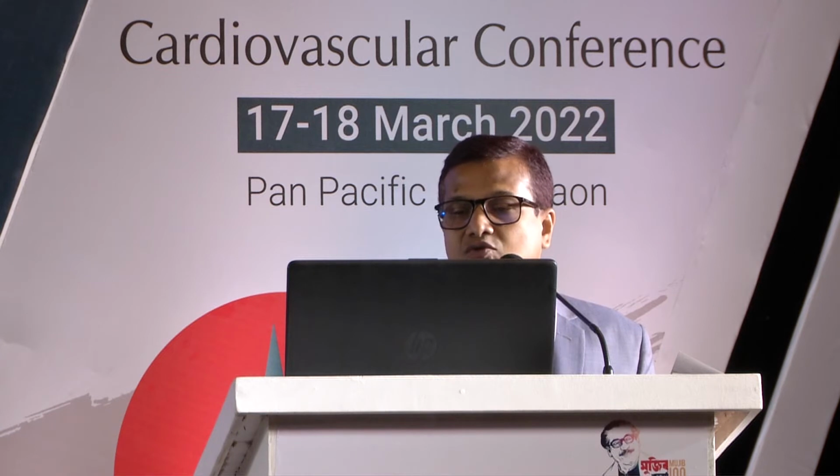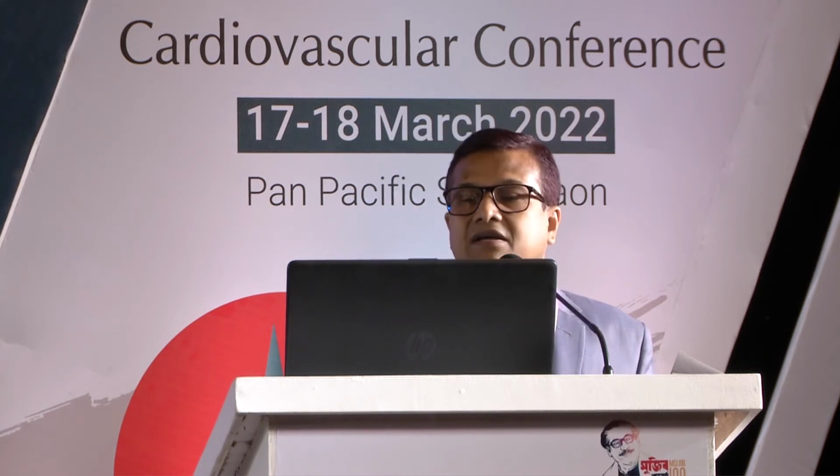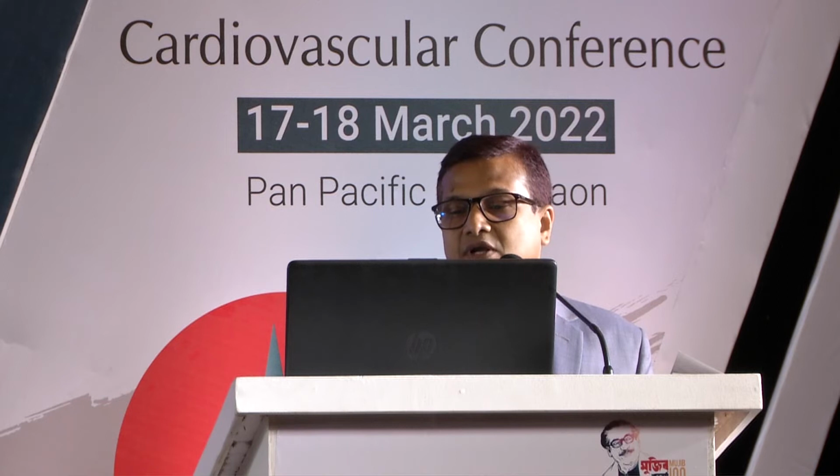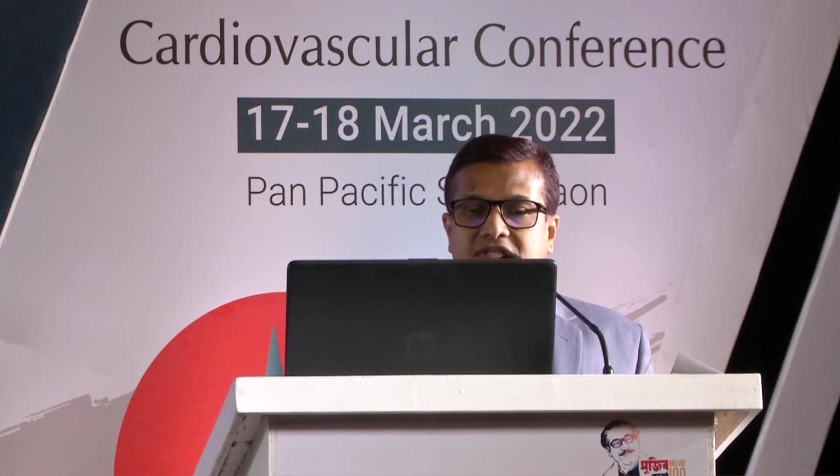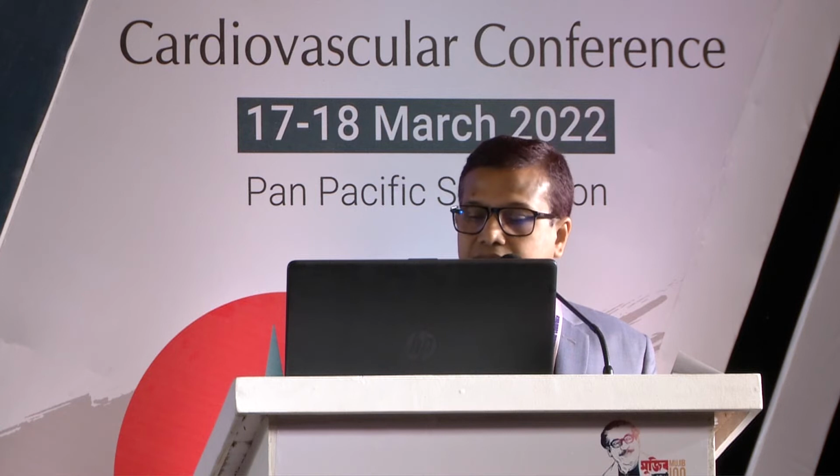RCA lesion was stented with a 3.5 by 48 millimeter DES at 14 to 20 ATM. Post-dilatation was done with a 4 by 10 millimeter balloon at 14 to 22 ATM. Final angiogram showed RCA was well dilated with TIMI 3 distal flow.